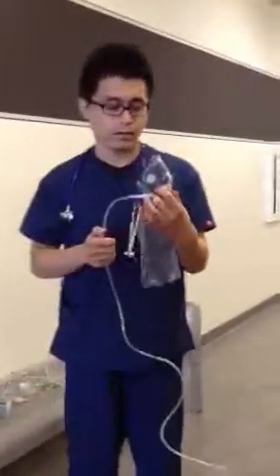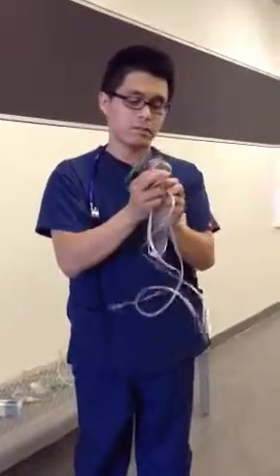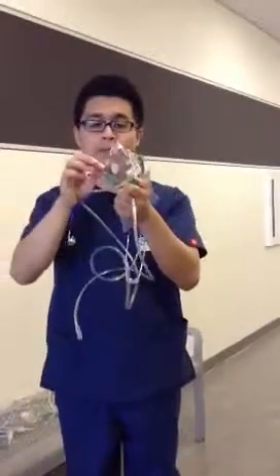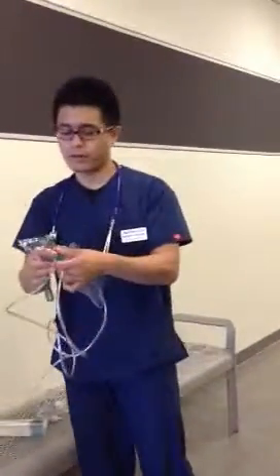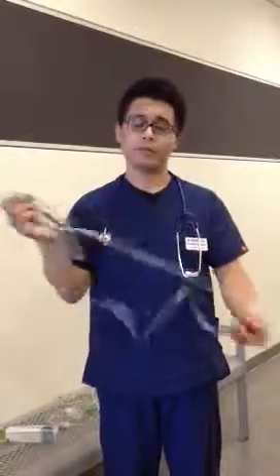Partial rebreather, you're going to get a new one and take off the back flap. This one is on wrong. See, this is one of the troubleshooting ones: this mask isn't in all the way. Now I'm able to take the back flap off and I take this one off. So partial rebreather, no flaps, none whatsoever. Before you place it on the patient, stick your finger right there and let the bag fill up before you place it on. Run it at least 10 liters per minute, and you're not going to run a humidifier with this because the reservoir bag can become a water trap, because water can condense.